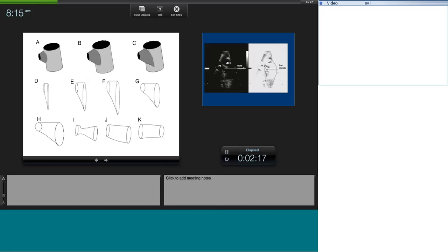Another important thing is that the ampulla may arise from the anterior or leftward aspect of the aorta. When it overlaps the aorta, this duct is best seen in the RAO view — in the lateral view you may think there is no ampulla. This matters particularly in tiny babies, where the aortic retention disc may stick out into the aorta. An accurate assessment of the ampulla is critical.